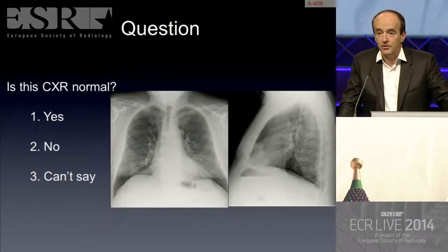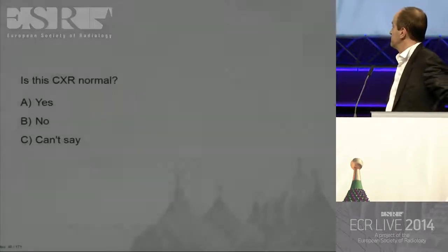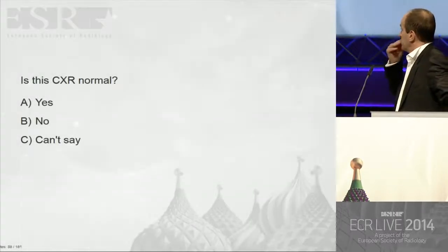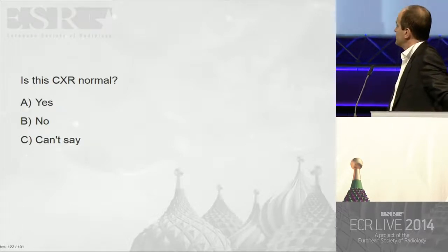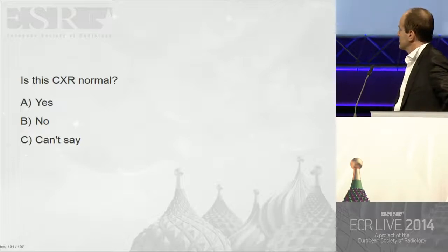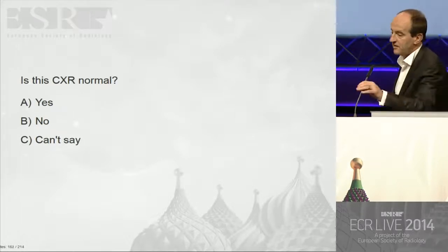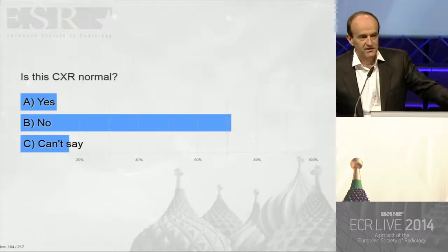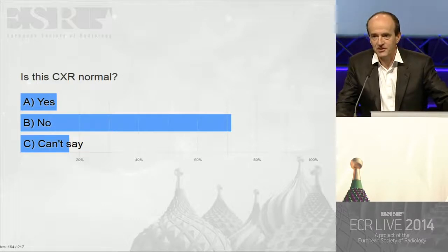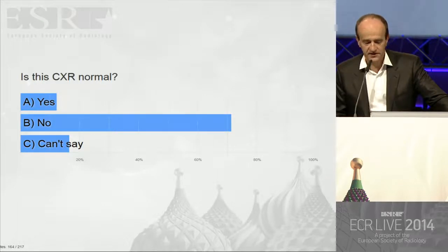Yes, no, or you can say. Okay. Let's show the results. It's no, okay, because the session is on missed lesions. But who saw the abnormality?